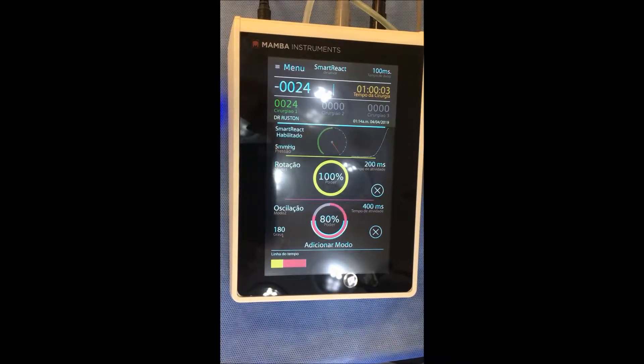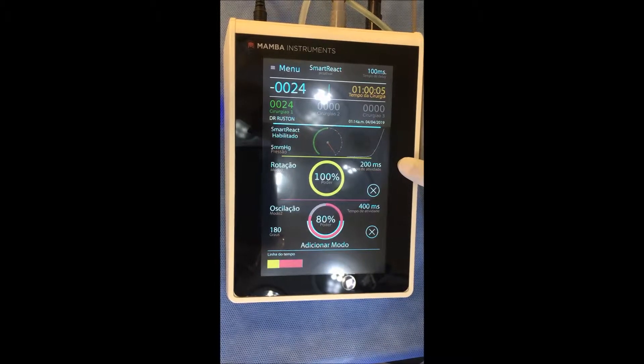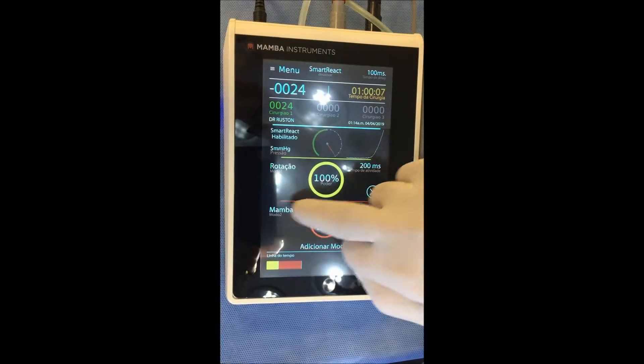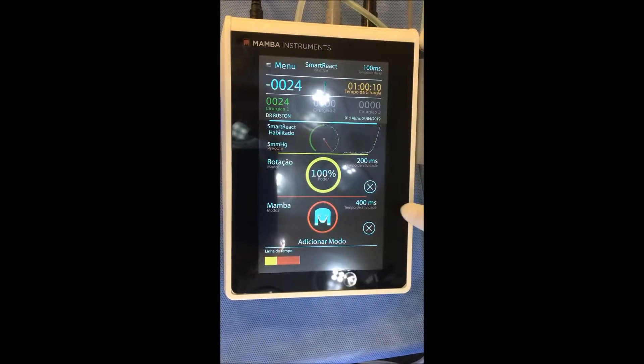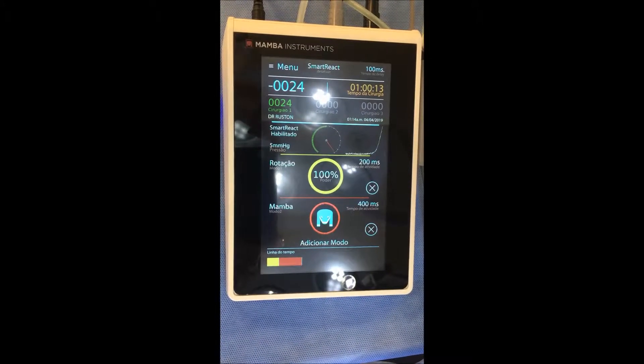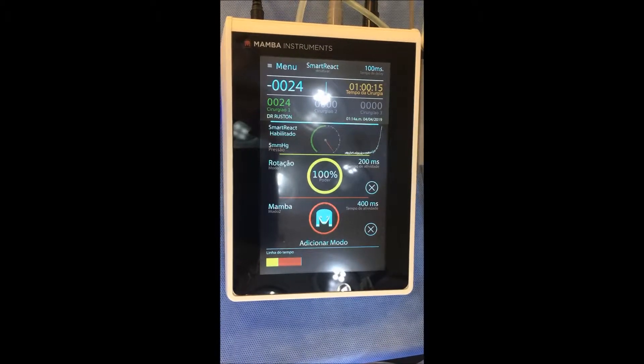Another setting you can start with is rotation 200 milliseconds plus mamba 400 milliseconds. I use mamba when I have a difficult case like splayed grafts, afro, and so on.